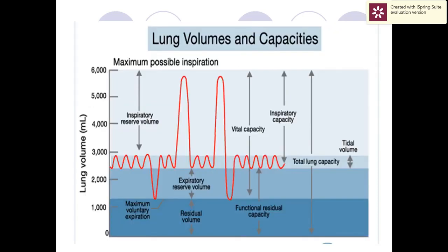زي ما احنا شايفين من الصورة الموضحة lung volume and capacity. طبعا الفرق بين ال volumes and capacity: ال volumes is one entity، ال capacity أكتر من two volumes or more combined together بنسميها capacity. في عنا هنا زي ما حكينا إن ال lung volume في residual volume، وهذا it's only measured by the advanced machine and cannot be measured by spirometer.